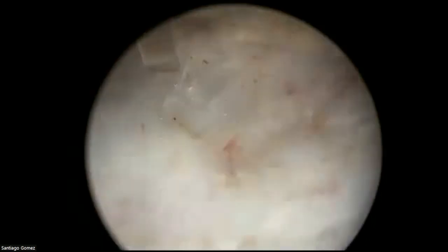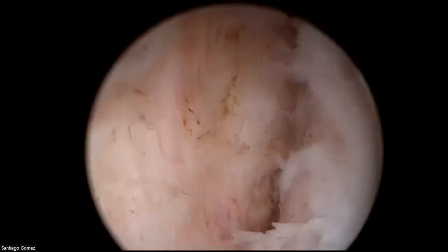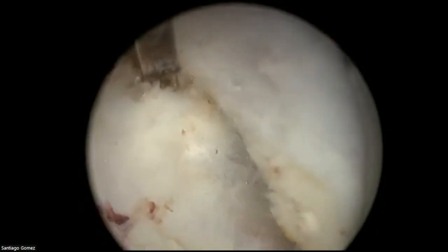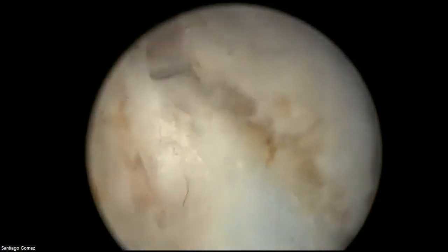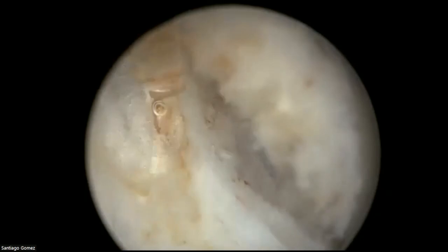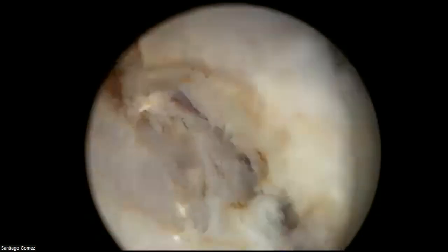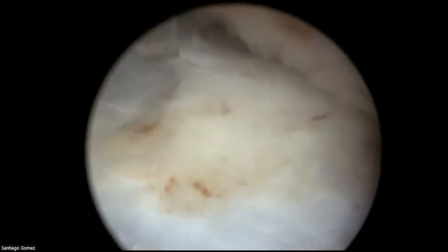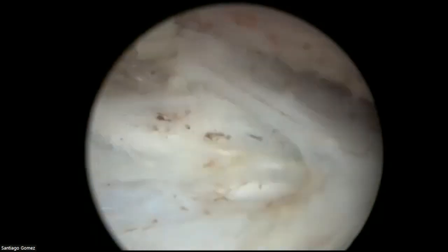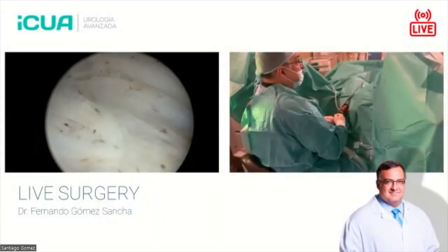You see, this is the posterior line that we are developing, but of course my original intention was to come here and try to connect with the bladder neck. You see here, we still have to detach a little bit. But you see, one of the advantages of the en-bloc technique is that we had an excellent view during the operation. You see that we didn't have to do cuts at the beginning. Most of the time, until we open the bladder, the irrigation of this space is very, very good because there's no passage of irrigation fluid to the bladder. You know, we are just irrigating the space between adenoma and capsule. And that gives you excellent visibility.